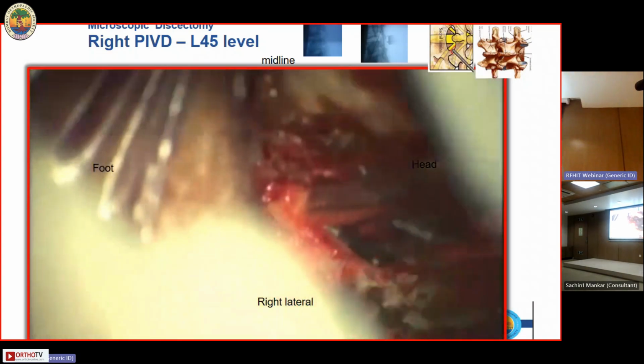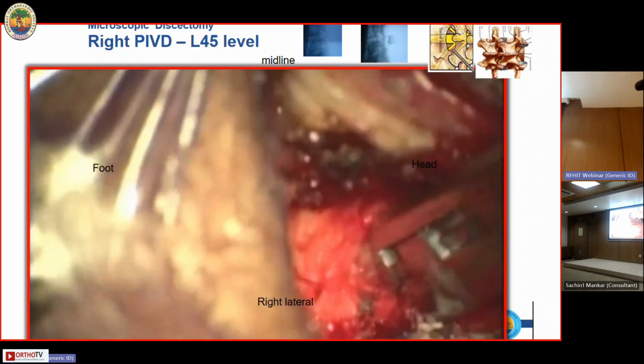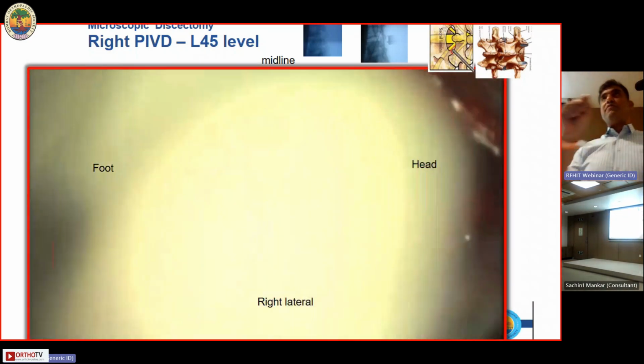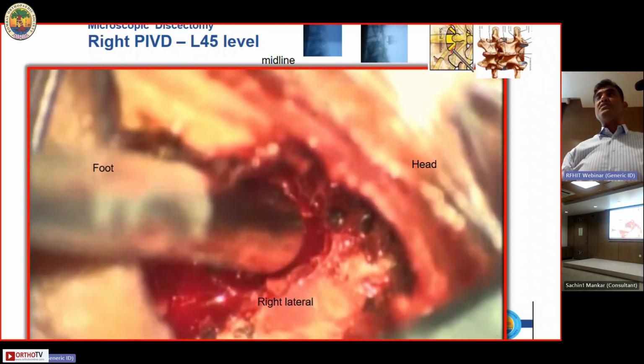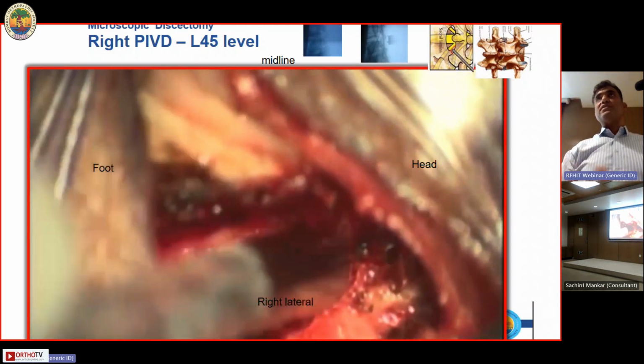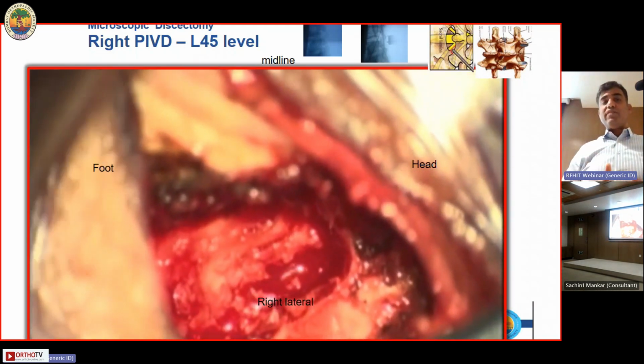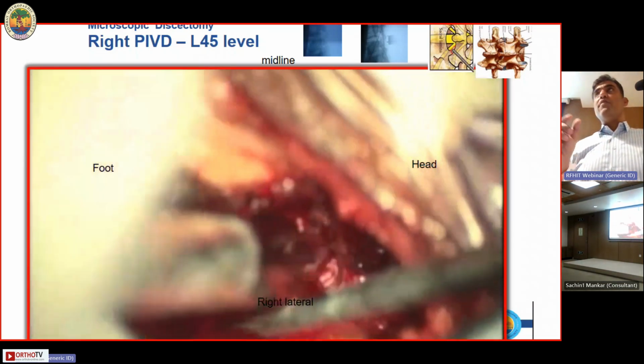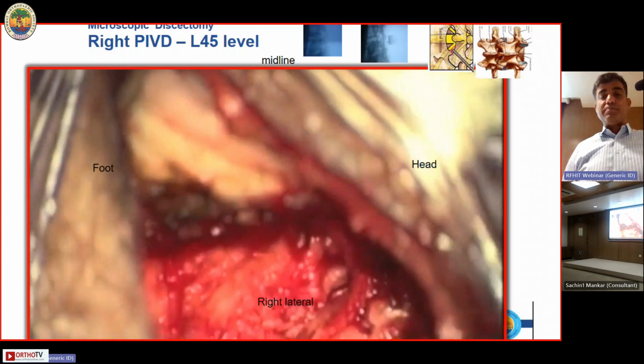And this is all happening after the muscle has been dissected from the spinous process laterally. So you go through the incision in the fascia in midline. Your skin incision and fascial incision is in the midline. Your muscle retraction happens there. The multifidus is retracted with the help of a blade, and the interspinous area gives you the force, or the lever, where the retraction is through the hook in the interspinous area.